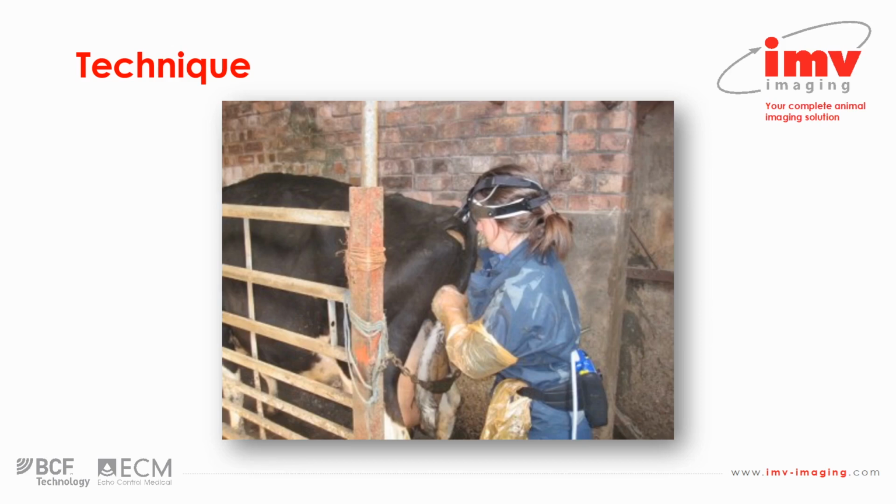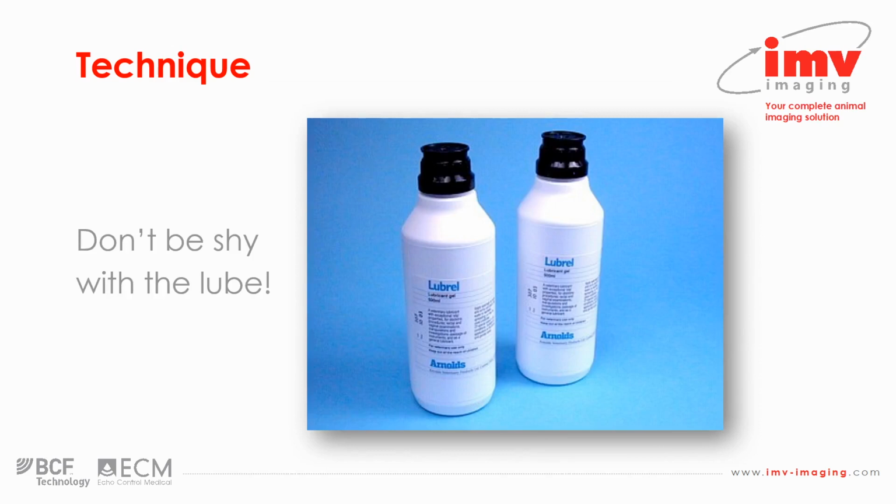One of the key things to consider when preparing to perform ultrasound, and in particular with regards to the animal's welfare, is to not be shy with the lube. These are 500ml bottles which you can get through quite quickly. You can also get lube available in much larger quantities, and I think the message really is you can't use too much, so make sure you've used plenty, and don't be afraid to grab some more if you're having difficulty introducing the hand into the rectum.